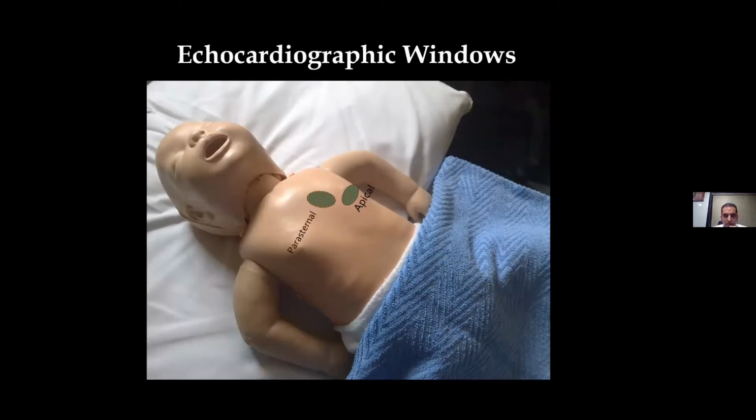Then we have the parasternal. This is the low parasternal views at the nipple line. Then we have the high parasternal views, or we also call them subclavicular views because they are just below the clavicle. Right subclavicular view, left subclavicular view. And then we have suprasternal notch, that is aortic view. And then we have subxiphoid or subcostal views. Okay, so these are the windows for different views.